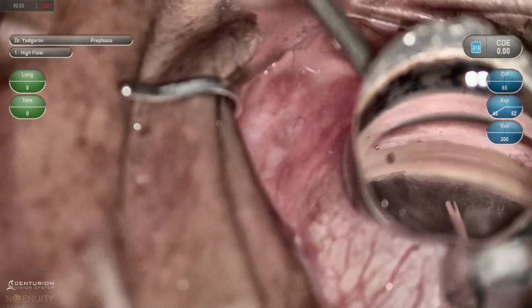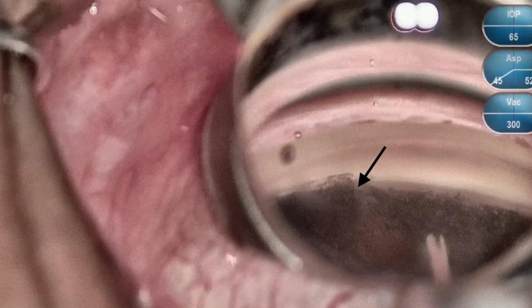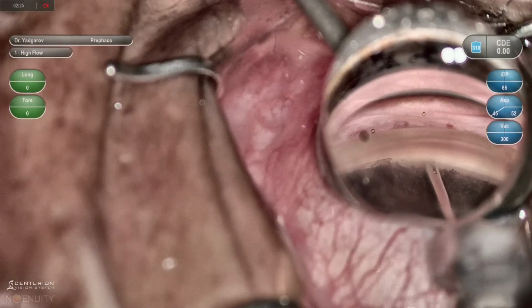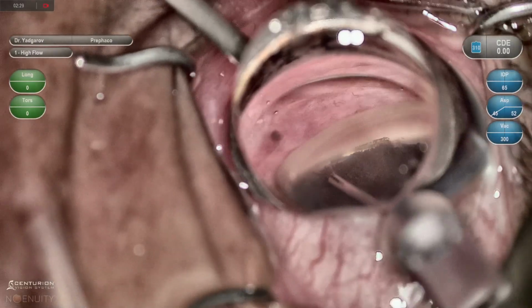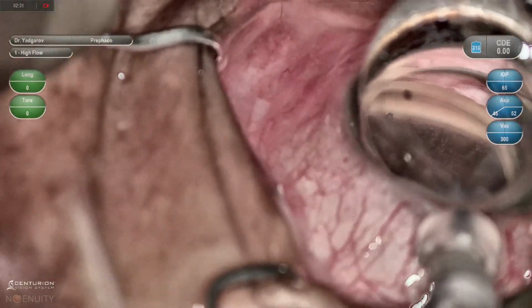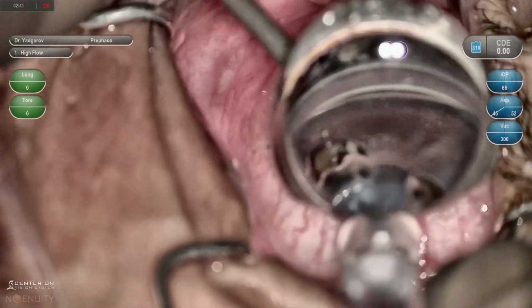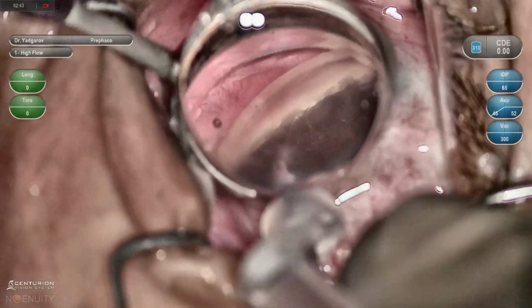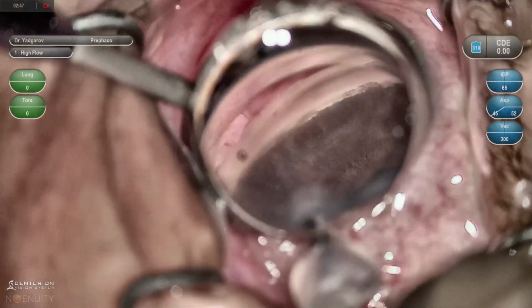The first case is a patient who's had a previous failed Hydrus stent, and you can see here there's a broad band of PAS completely obstructing the inlet. Since there's no room to implant these I-stents to the left of the Hydrus, as you can see here, I put all three I-stent Infinites to the right.